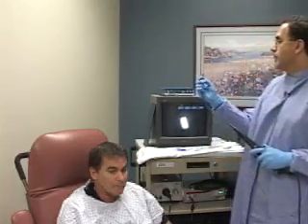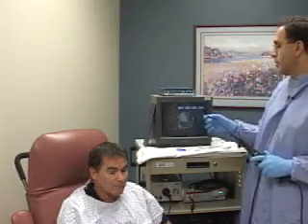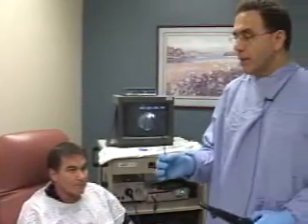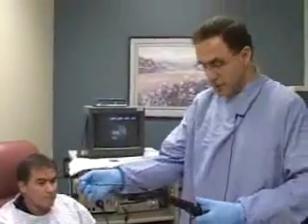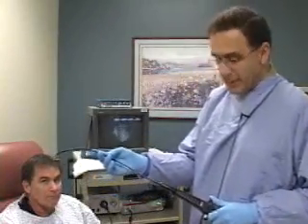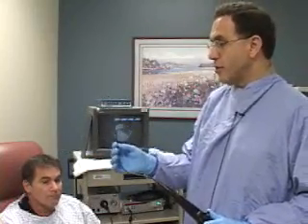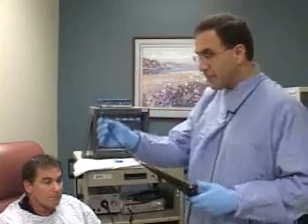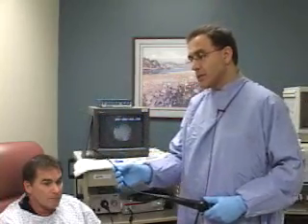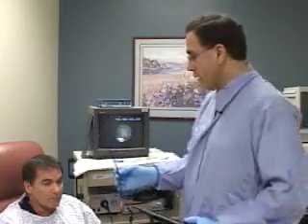Now, for this procedure, we do not use any anesthetics. Simple lubricants such as KY jelly will do. The endoscope is quite small, has an outer diameter of 3.1 millimeter. This is basically a laryngoscope, and as such is handled a little different than the upper endoscope. Most individuals tolerate passage of this small caliber endoscope through the nasal cavity very well.